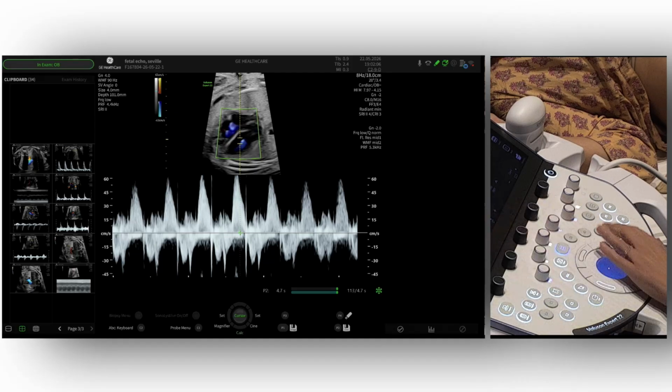And then we can measure the rate of the ventricle, the ventricular heart rate. We can also measure the atrial heart rate, measured at the atrial contraction. That would be more or less like this.